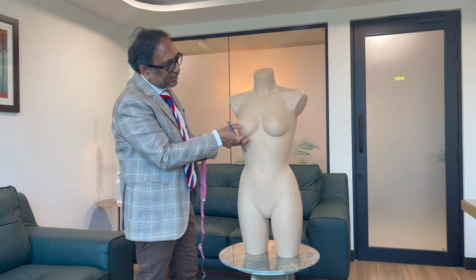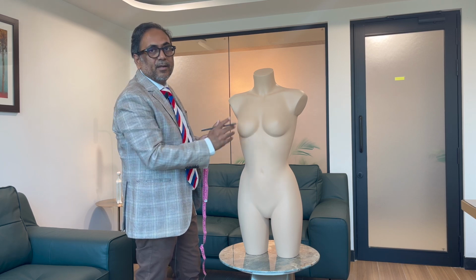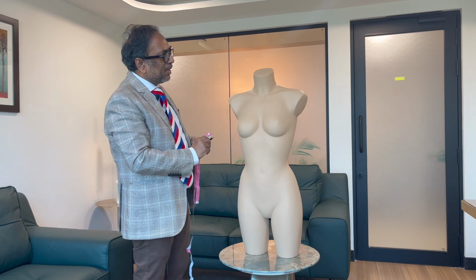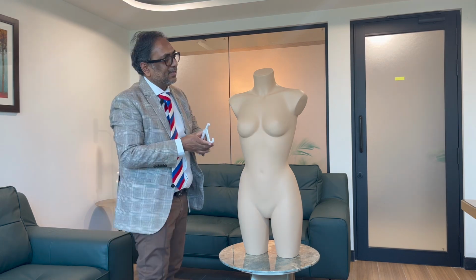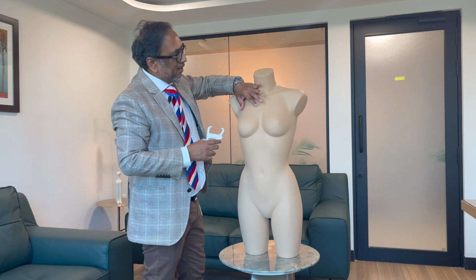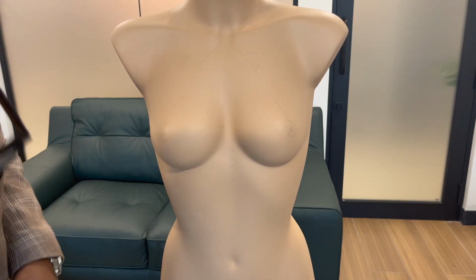However, if the distance is too big, we can probably think of accommodating a bigger implant in this particular patient. Now, the other measurements which we take are the skin thickness, the infraclavicular skin thickness. We hold our skin like this and we take the thickness of the skin.